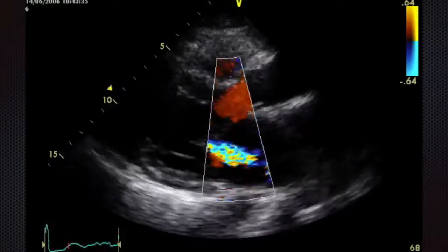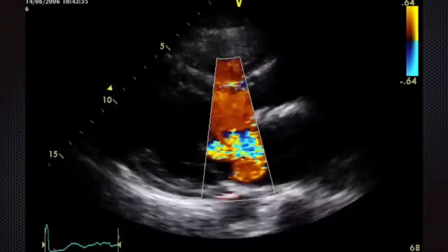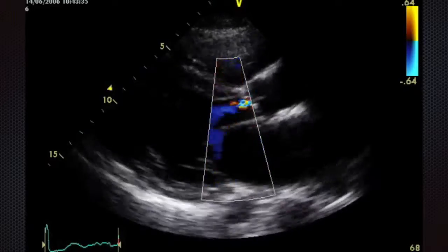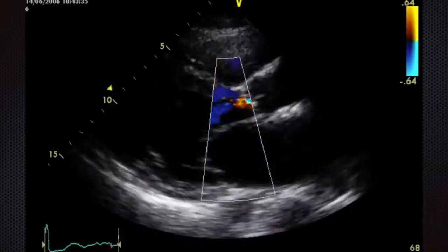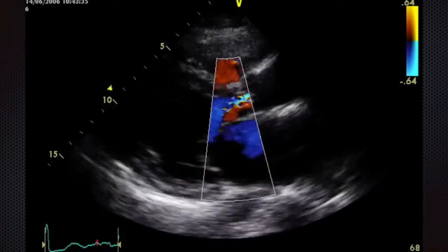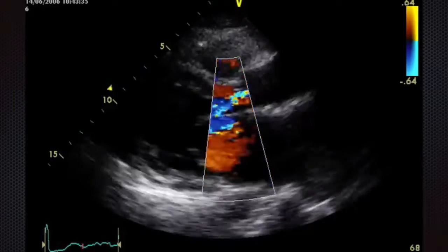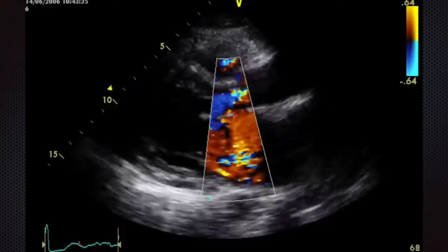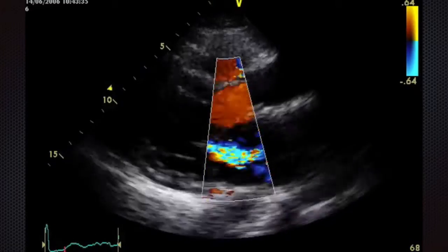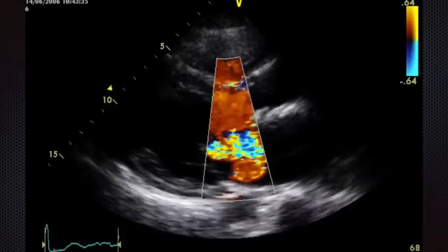Now you see both these as movement of blue and there's red seen, and there's also some turbulence flow where it's gone lighter and with little bits of potential greening. So there's valve lesions to the aortic and mitral valve here, and it's showing flow during systole back through the mitral valve, which is opposite to what you'd expect. And during diastole, there's flow backwards, so blue away, as you can see in the top jet during the relaxing phase. So both these valves are abnormal in this image.